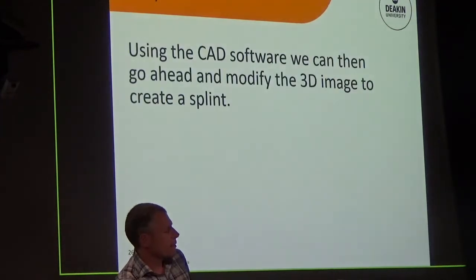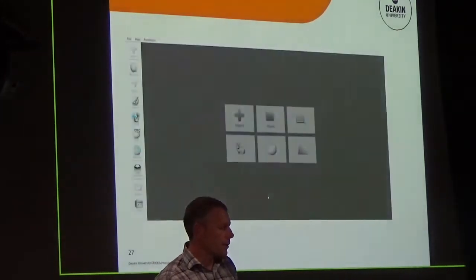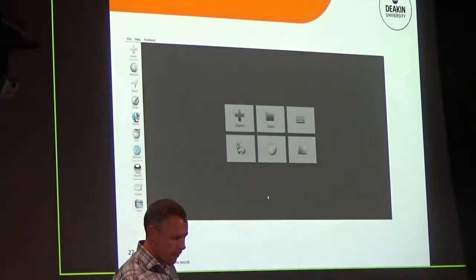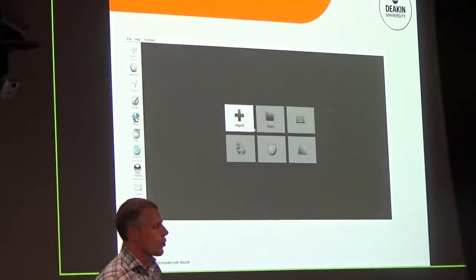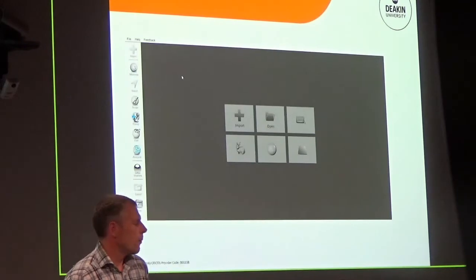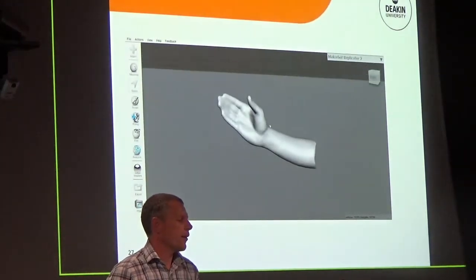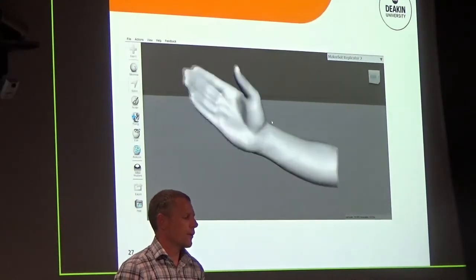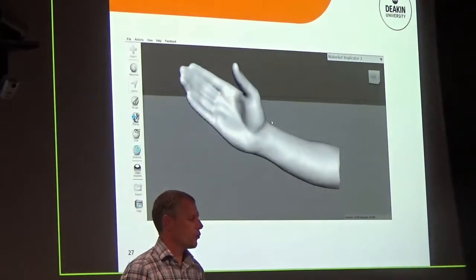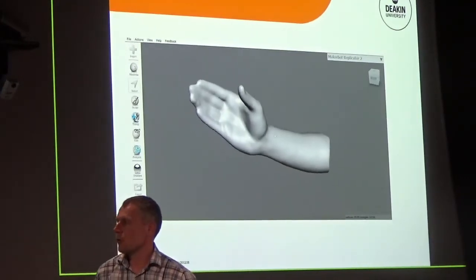So using that software, once you've got an image of someone's limb, of whatever part it might be, you can go ahead and modify it. So again, this is just a quick bit of me doing some work on Meshmixer. So that image that you saw of an upper limb before, that was in the screen. Basically, this is back to the good old days of Paint software in your Microsoft, similar sort of stuff that you can go through there.